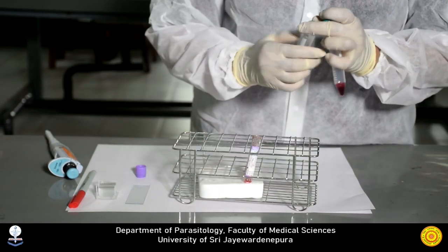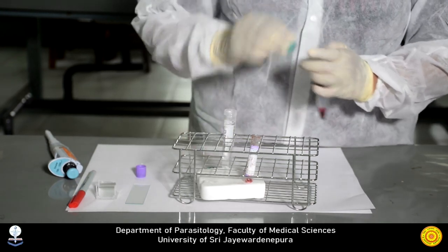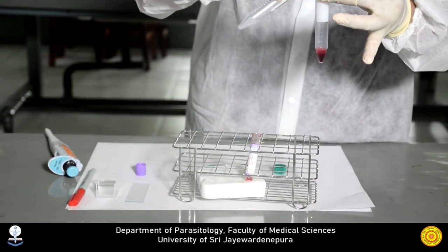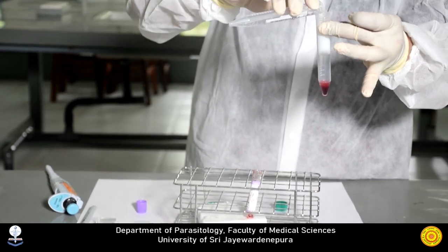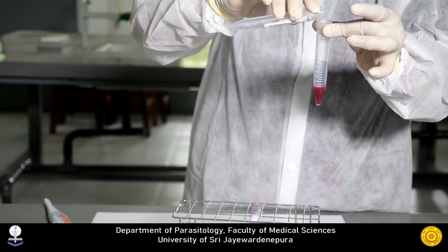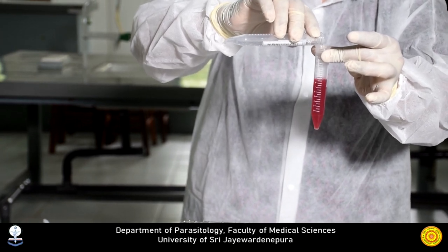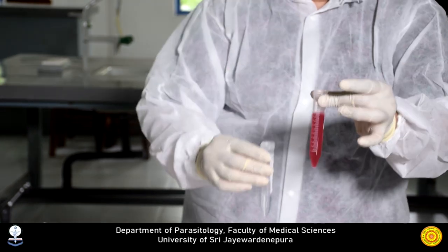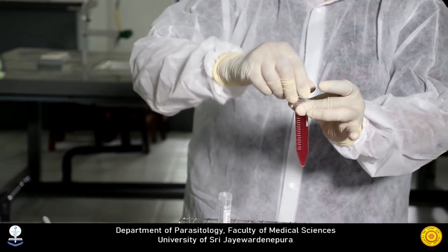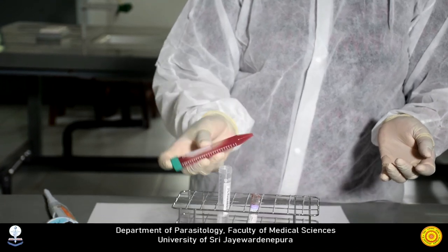One ml of venous blood was added to the centrifuge tube. Now we are adding 2% formalin to the centrifuge tube. The next step is to centrifuge this mixture at 500 G for 10 minutes.